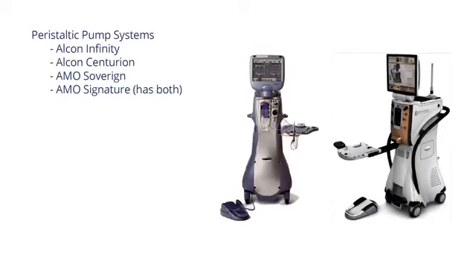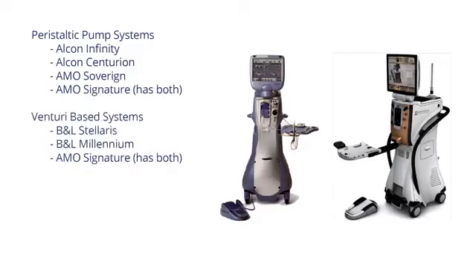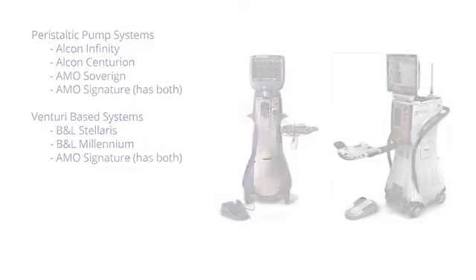Peristaltic pump systems include the Alcon Infinity, Alcon Centurion, AMO Sovereign and the AMO Signature. Venturi-based systems available today include the Bausch + Lomb Stellaris, the Bausch + Lomb Millennium and the AMO Signature, which has both pumps included.